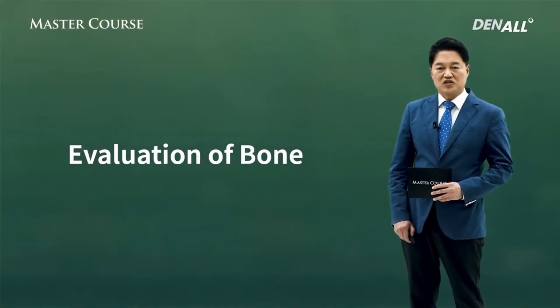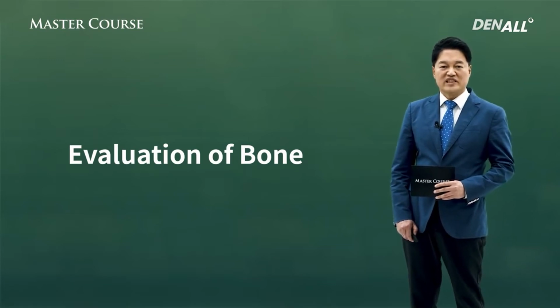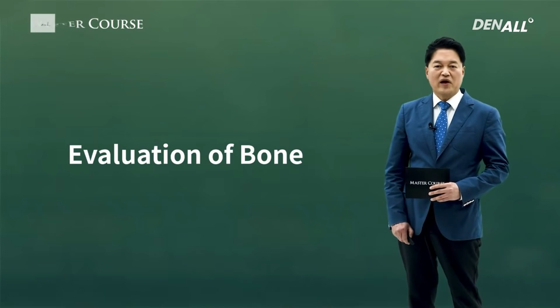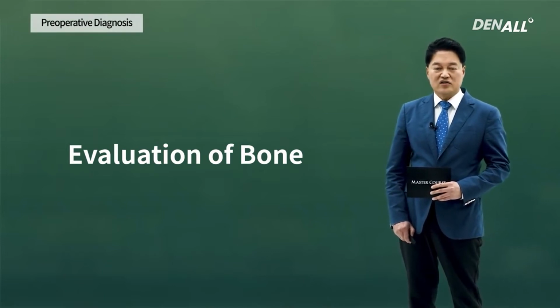Up until now, based on the information gathered through radiographic images and CT, we need to evaluate the bone where the implant is going to be placed. Evaluation of bone can be divided into bone quantity and bone quality, and I'm going to talk about bone quantity.